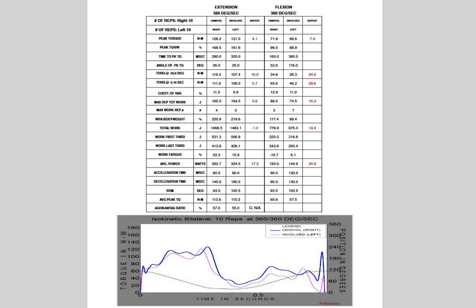Hello there everyone. This is a quick video in which we're going to talk about the features of a full isokinetic report, such as you will need to interpret for your summative assessment for this module.